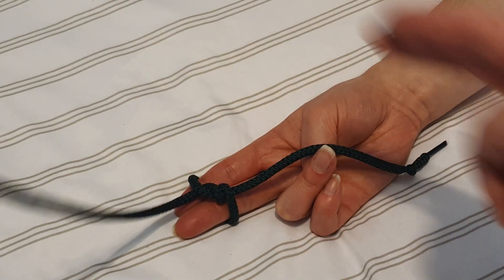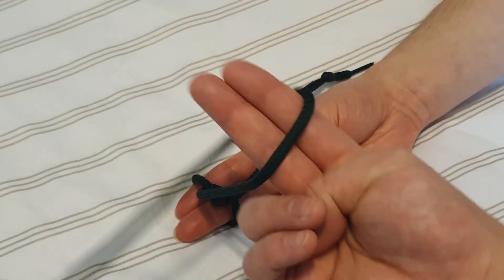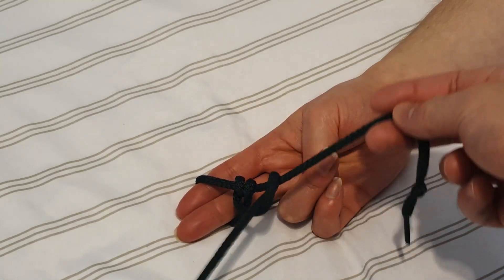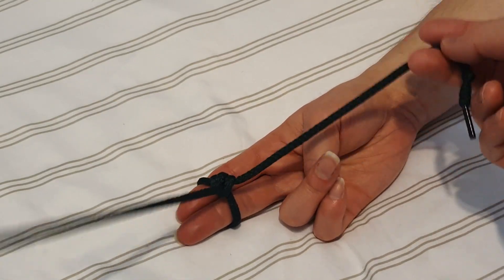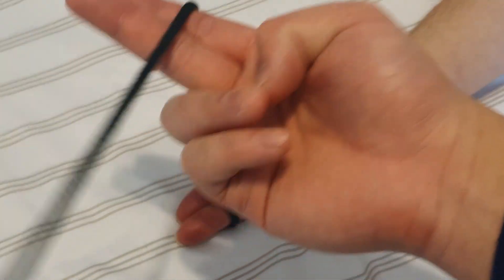This is the starting point with the short end to your right and the long end to your left. We can now form this V — right here, imagine it's a V — making a loop on the inside of the V with the long end. Grab the short end and pull through to the right.